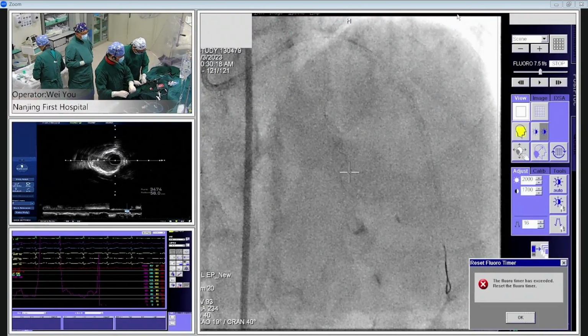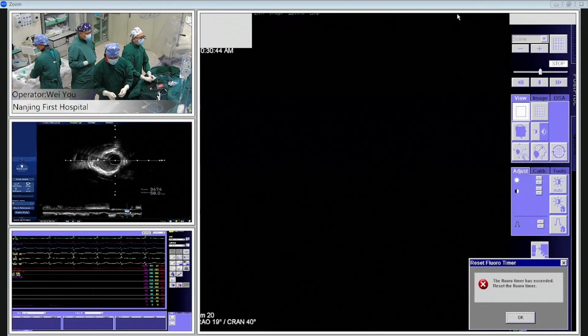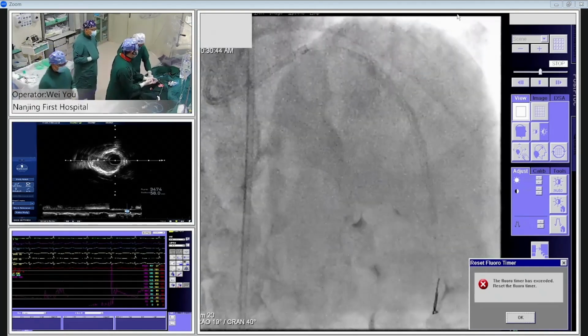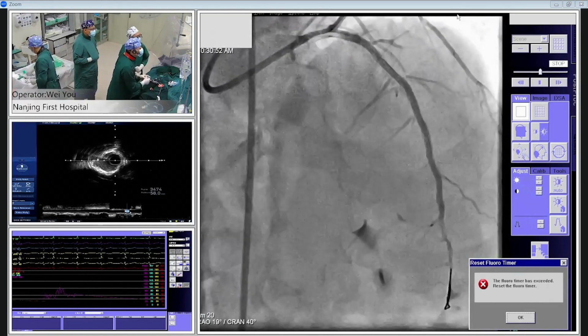The guiding tip should not be intubated too much because the proximal stent may not be fully positioned. The intubation of the guiding catheter tip may induce stent deformation. Yes, Chief. When I retrieved the long stent balloon, I felt resistance, and the guiding catheter tip was deeply seated.